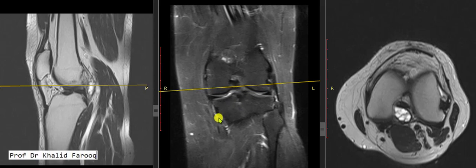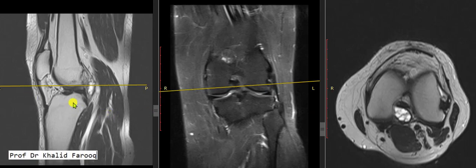Bismillah ar-Rahman ar-Raheem. Assalamu alaikum wa rahmatullah. Here we have an MRI of the knee of a 26-year-old male patient who presented with an old history of knee injury. This is a sagittal T2-weighted sequence, this one is a coronal T2-weighted fat suppression sequence, and here we have an axial T2-weighted sequence.